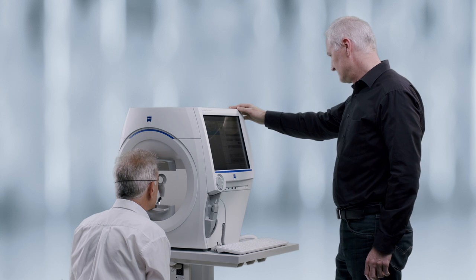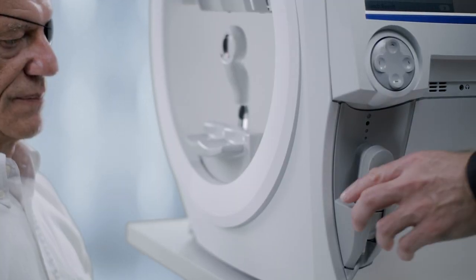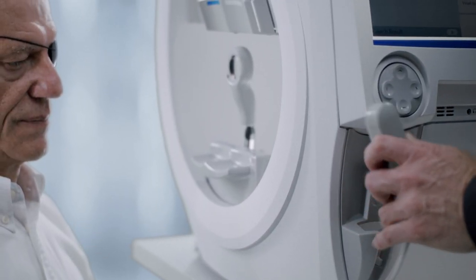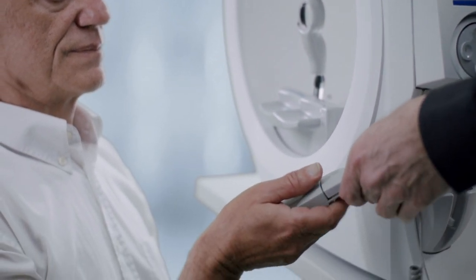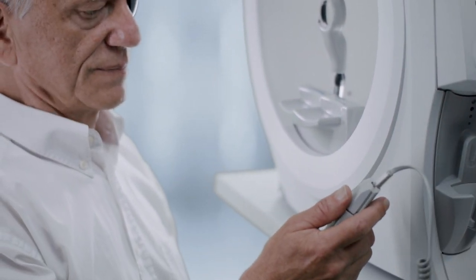Patients are most comfortable when sitting more or less erect, preferably in an office chair with armrests. Hand the response button to the patient and explain how to use it. Even experienced patients may have forgotten how to take the test since their last visit.